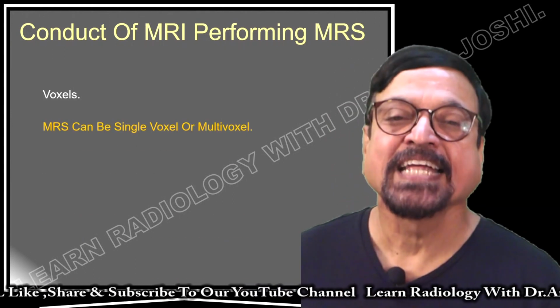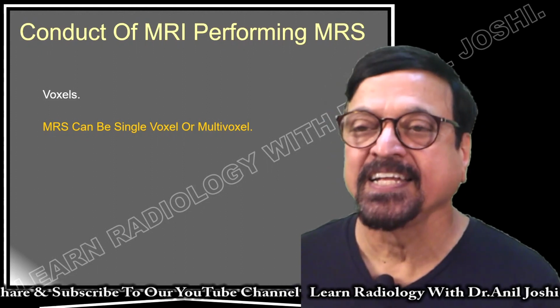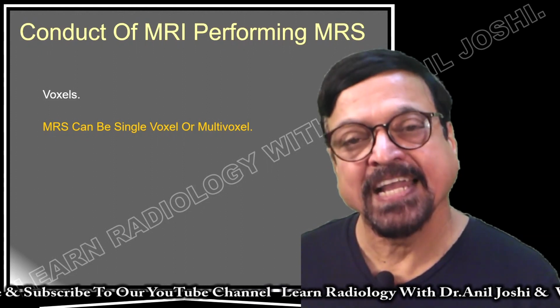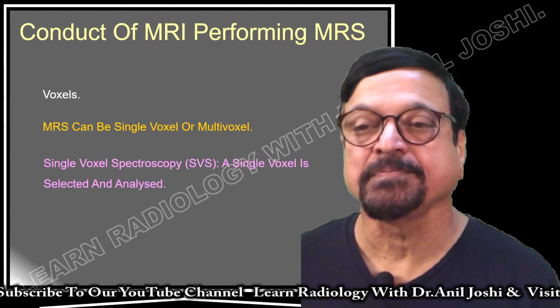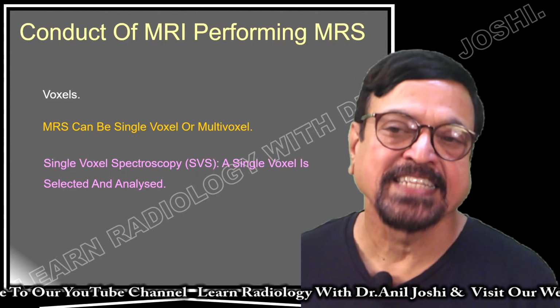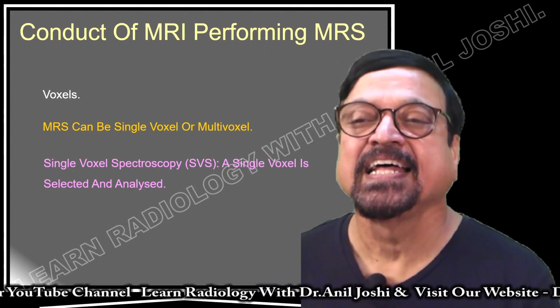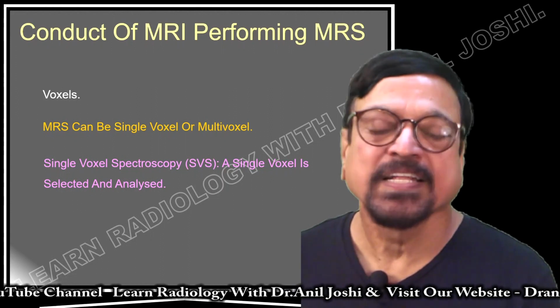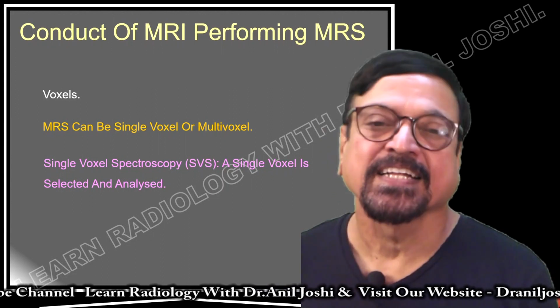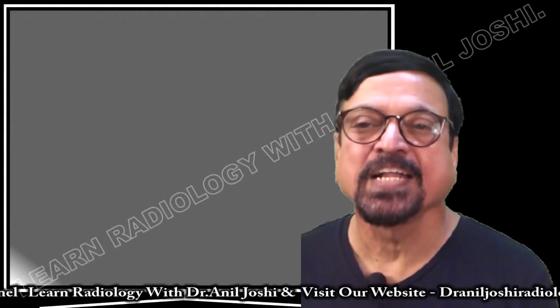Now, details about voxels we have discussed in some other lecture. Do visit it. The MRS can be a single voxel or multivoxel. We are going to discuss the advantages and disadvantages of single voxel versus multivoxel. Single voxel has certain advantages, certain disadvantages. So also for the multivoxel, we'll see them subsequently.